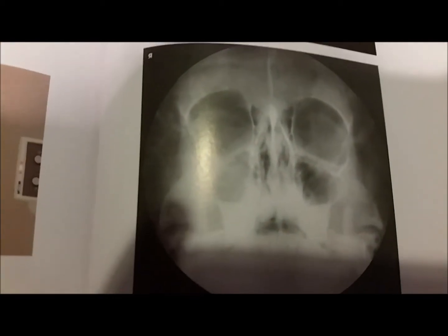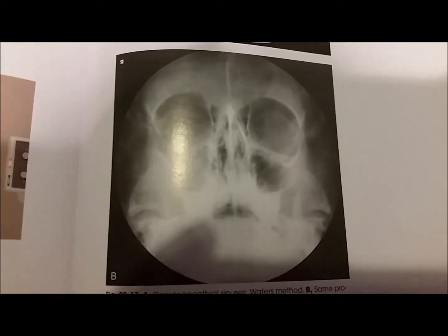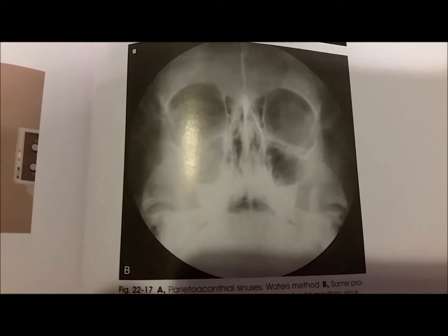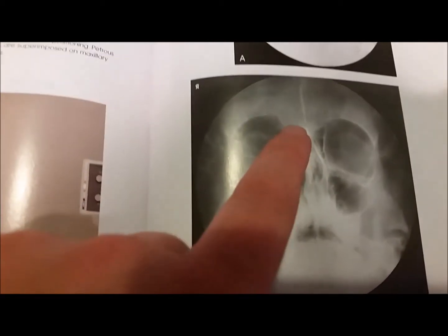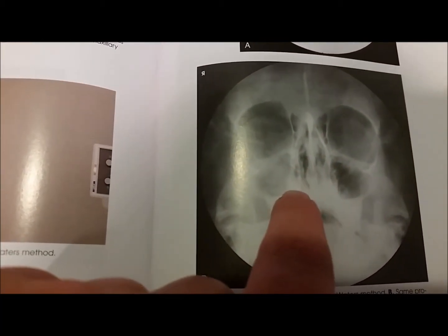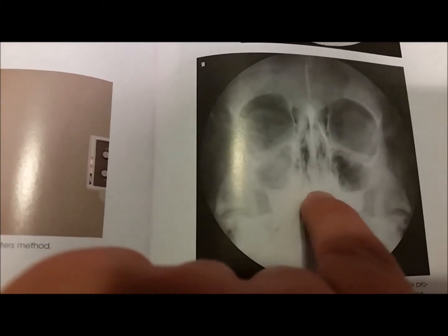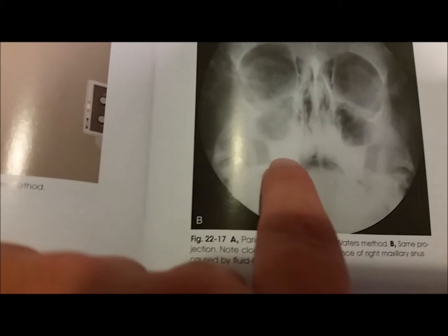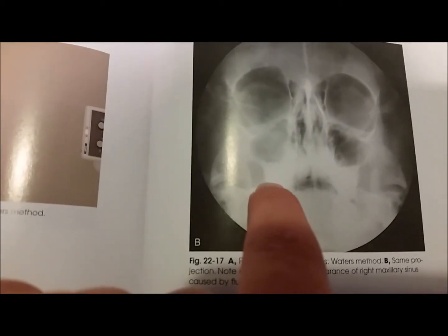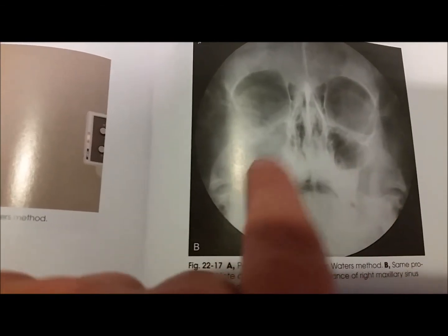Next we have the parietoacanthial Waters view here. For this one, we're looking primarily at the maxillary sinuses, although you can make out the frontal and the ethmoid a little bit right there as well. But primarily, we're looking at the maxillary right there, with the petrous ridges below them to make sure that they're not superimposed and can be seen whether they're clear or not, such as in this image right here.